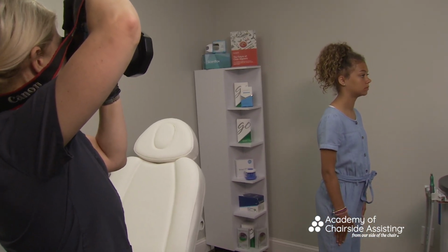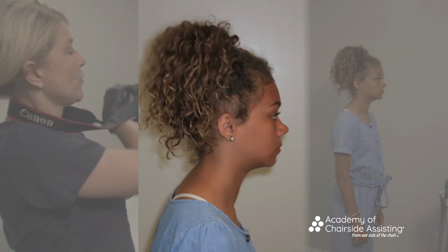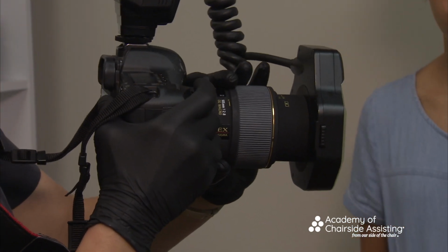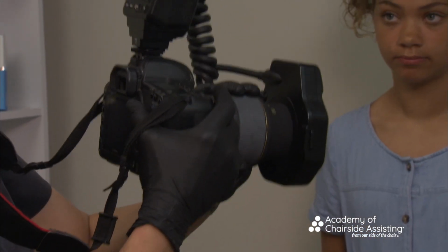Sometimes we'll blame it on the camera. But the further away she moves, closer to me, the less shadow we're going to have. You'll see that it wasn't as prominent. One of the things that I want you to think about is look at how I'm holding the camera. I've got stability here. I've got my finger on the trigger, I'm holding it correctly.